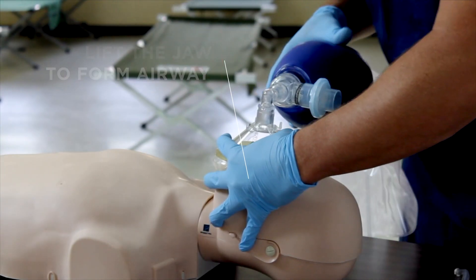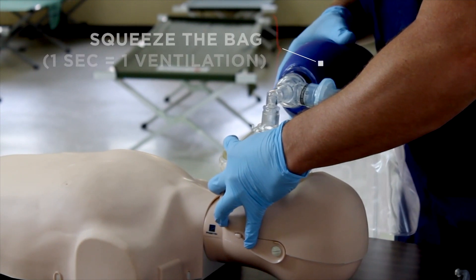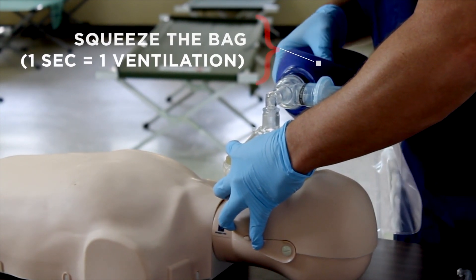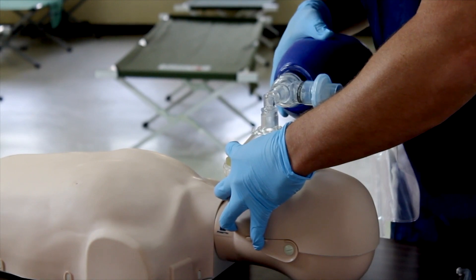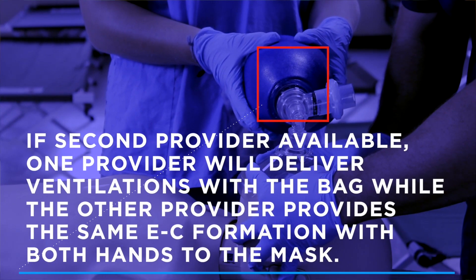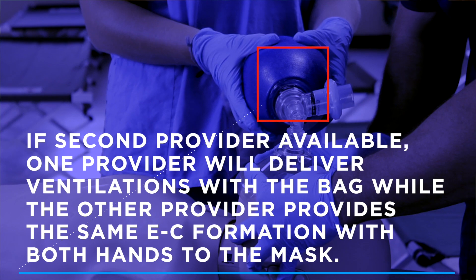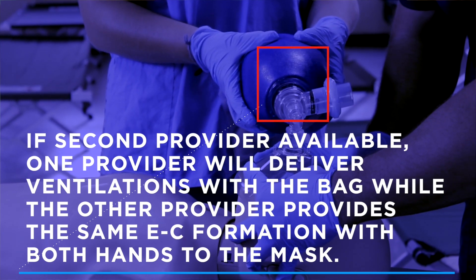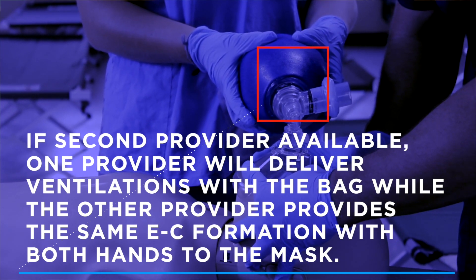Maintaining this position, the provider squeezes the bag, taking one second to provide one ventilation. If a second provider is available to assist with bag mask ventilation, one provider will deliver ventilations with the bag mask, while the other provider provides the same EC formation with both hands on the mask.